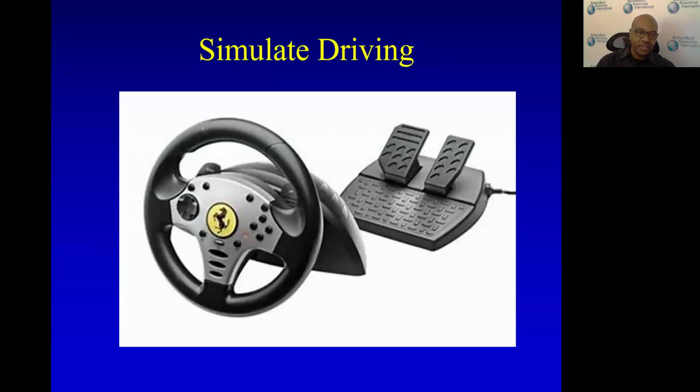Another thing you could do is use a driving simulator. So it could be something on the computer, and you could be monitoring the EMG in the upper back while they're driving, or other muscle areas, the face, the arms, while they're driving. And on a simulation, it could be a separate device like a PlayStation or something like that, or it could be a driving simulation game on the same computer that you're doing the biofeedback on. And you could have one screen that has the driving on it, and the second screen that has the EMG signal on it.